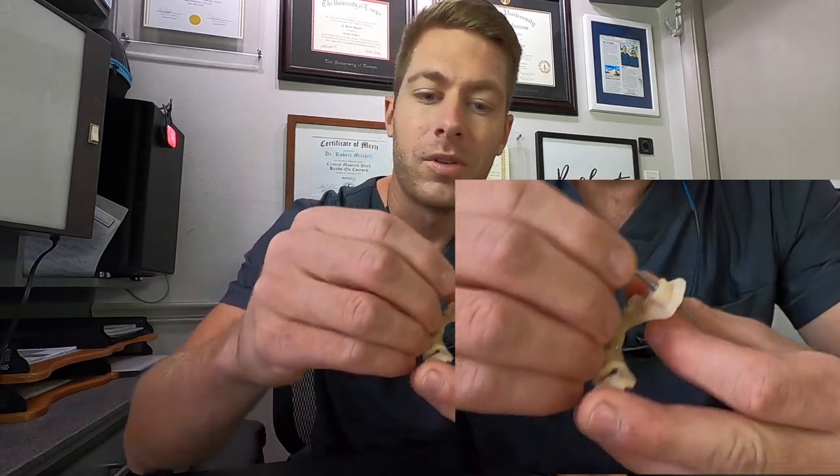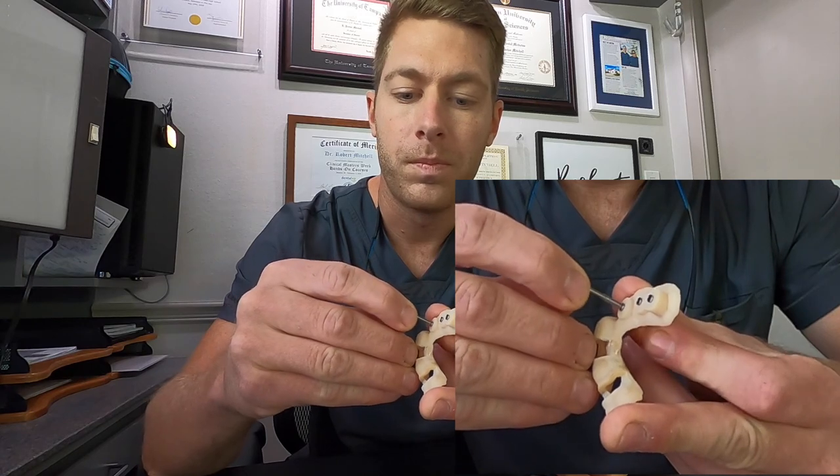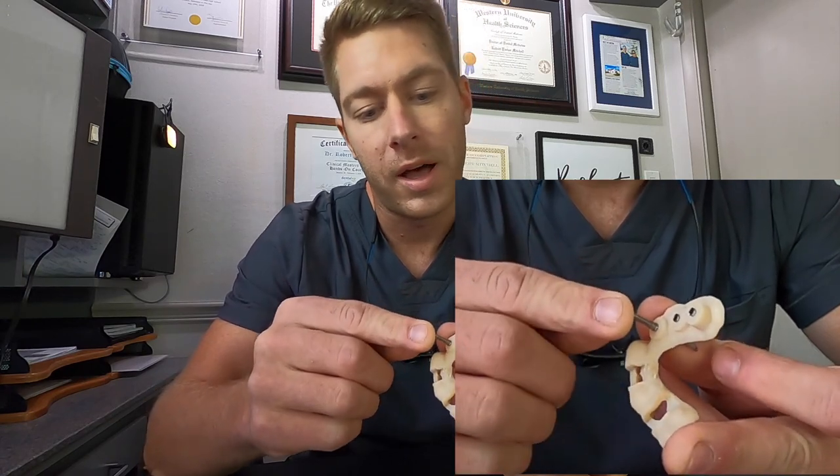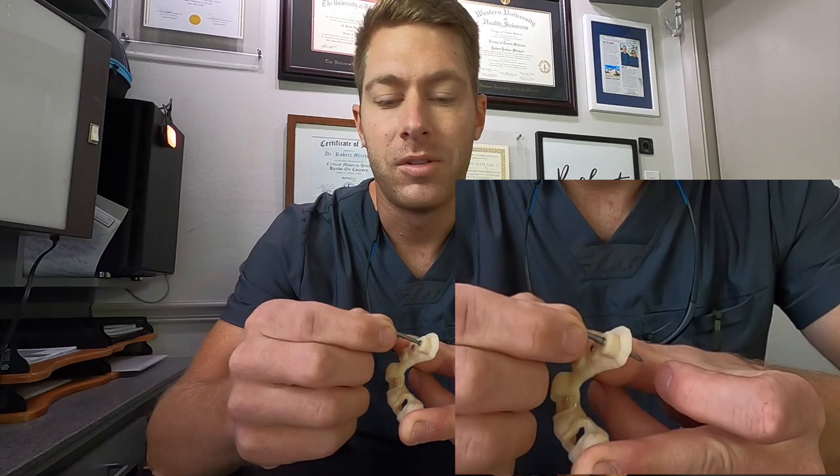For instance this drill once seated completely on her teeth I used and went through the guide on each one of these spots to get my pilot hole exactly where I want it to. Now a lot of dentists tend to freehand this but I have learned that if I spend the extra time to plan this digitally have these guides 3D printed that the results come out way better and the surgeries are a lot more efficient and quicker. And when the surgeries are more efficient and quicker patients tend to have better healing they end up being in less pain and it's a win-win for everybody involved.